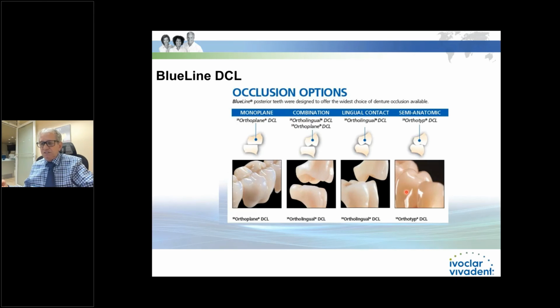If I got a patient that's bad about chipping or dropping teeth, I'm going to go either blue line, or the Vivadent S DCL or the Vivadent SPE, because they're all the same materials. They're both double cross-link. Anytime you want to use teeth, stay with double cross-link. Don't use single unless there's a reason for that, and definitely don't use a regular PMMA, because your wear is not going to be there.